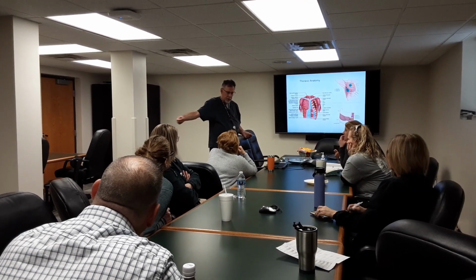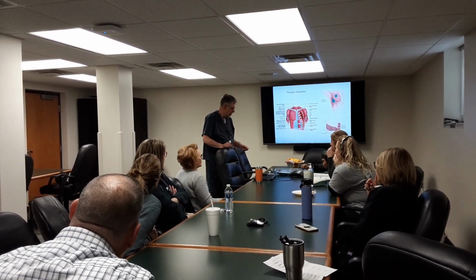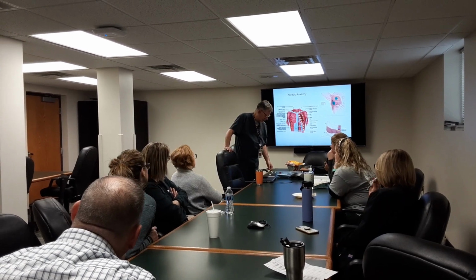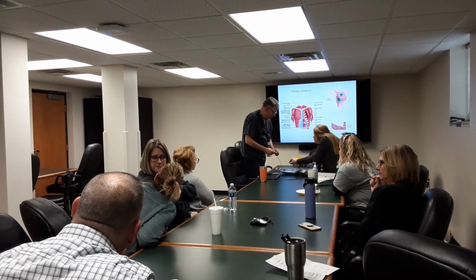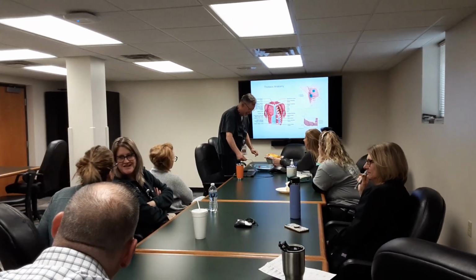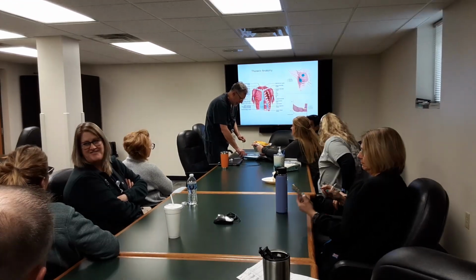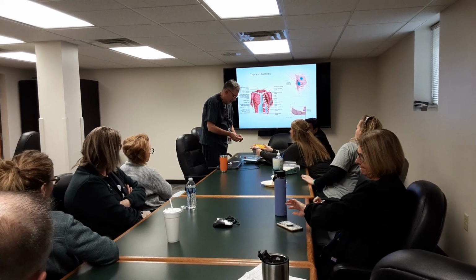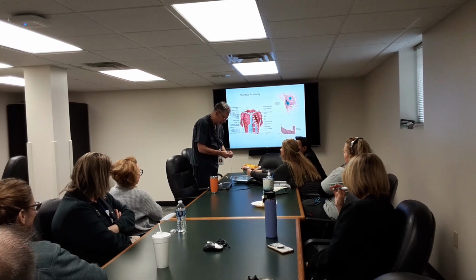So this went in, and then this comes out, the wire stays in. Okay, so you put the wire over that needle. The wire goes in through the needle. Yeah, that's what I meant. And then it comes out. That's what I wanted. This wire is in. Okay, yeah, I'm doing that. So this is gonna be thin just like this, and then you're gonna, yeah. All right, let me do one.